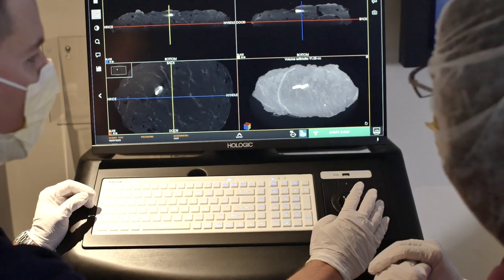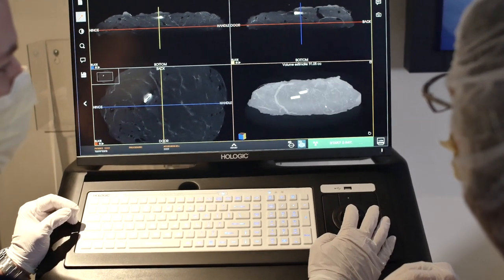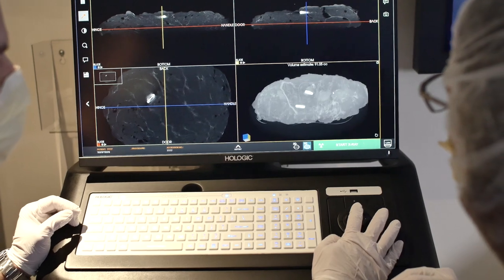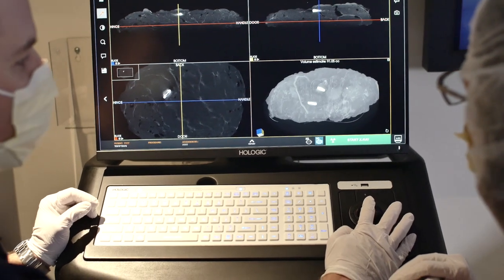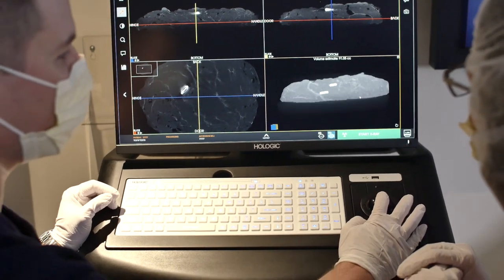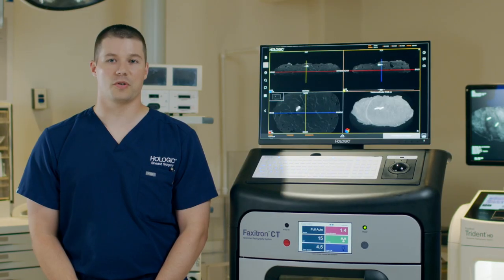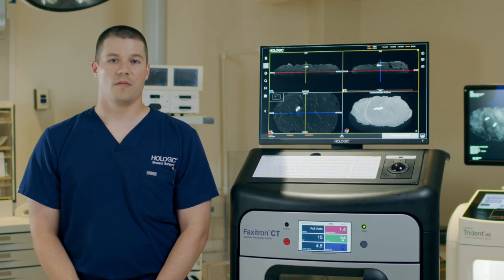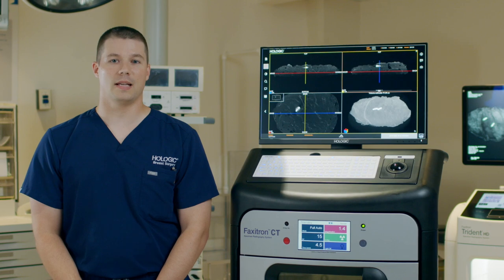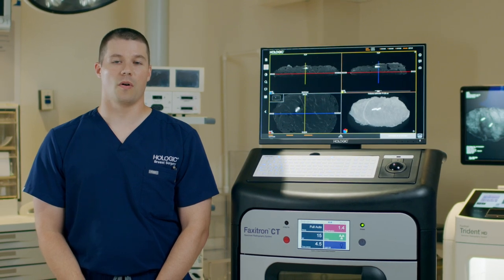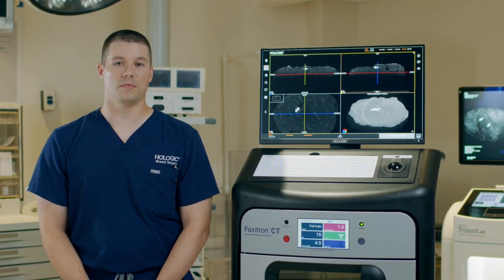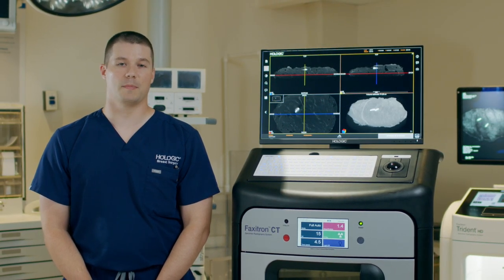The CT also calculates specimen volume and Hounsfield units, which are beneficial metrics for quantifying density and overall 3D volume size of the specimen.